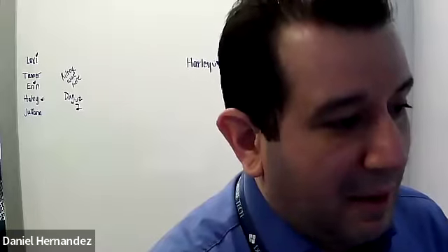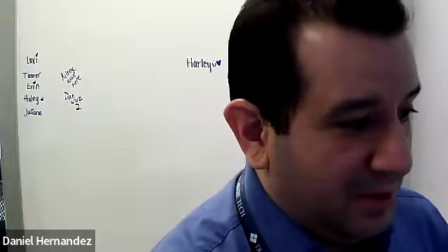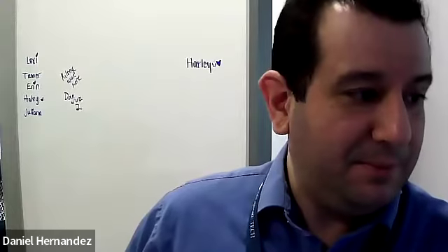So here we can see that appendicolith. It looks like a gallstone. It'll shadow like a gallstone. So this is almost a centimeter. So that's a big guy. It's pretty big, these appendicoliths.